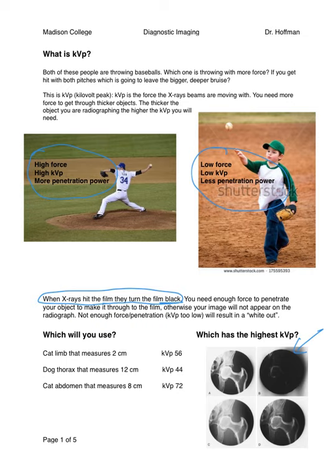And if we look down here at the bottom one, that's a pretty white looking image. Those x-rays didn't get thrown out with quite enough force. We need more force to penetrate fully through the object. So this is what force is going to do for us. We want the right degree of blackness on our film. We don't want it to be completely burned through, and we don't want it to be completely light.